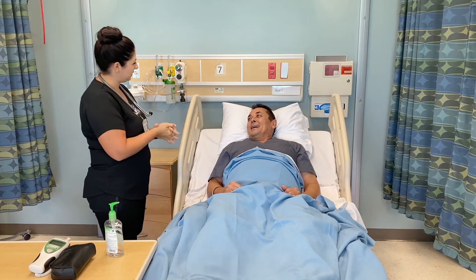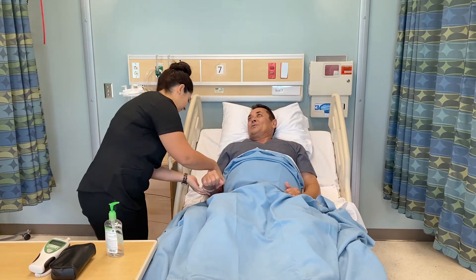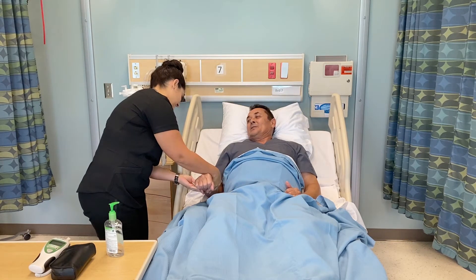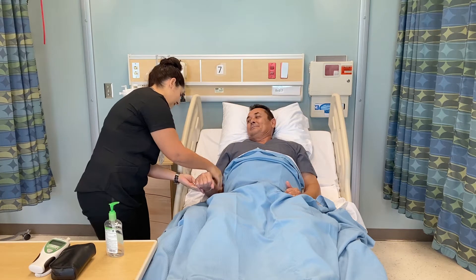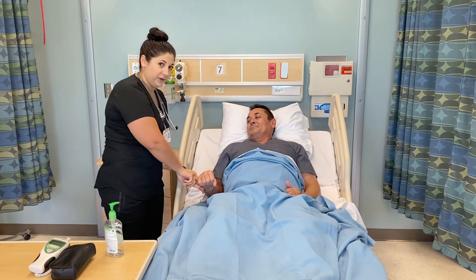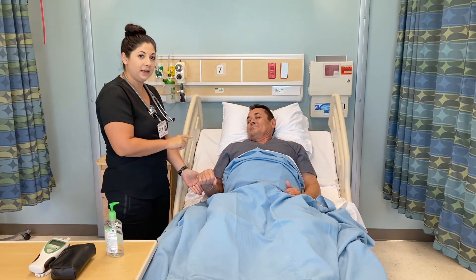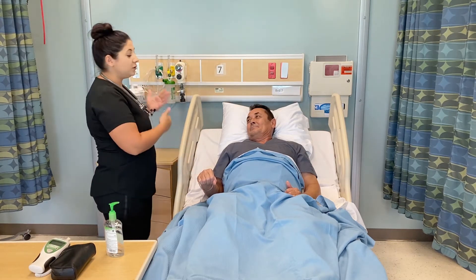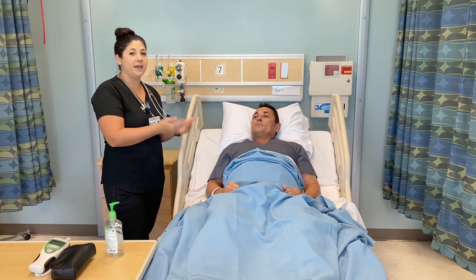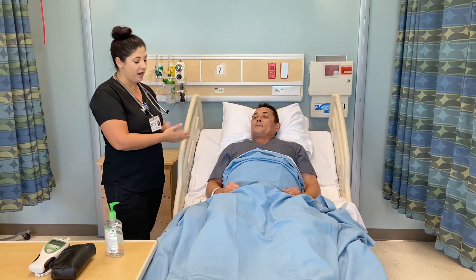Can you tell me your name and date of birth? My name is Bob Caffrey, my date of birth is January 26, 1962. I am checking the armband to make sure that it matches what he's saying, and also checking my order to make sure that matches the patient that I have.